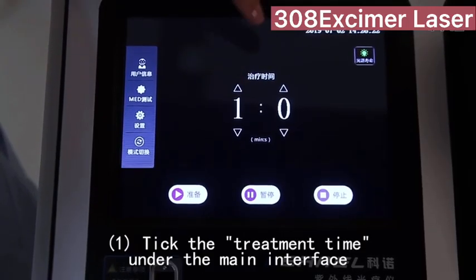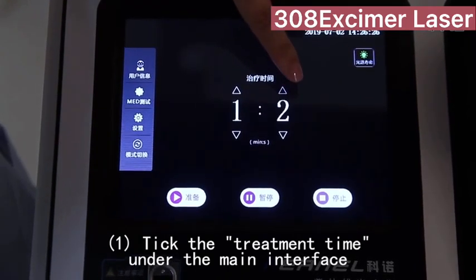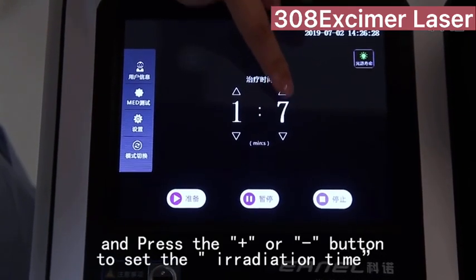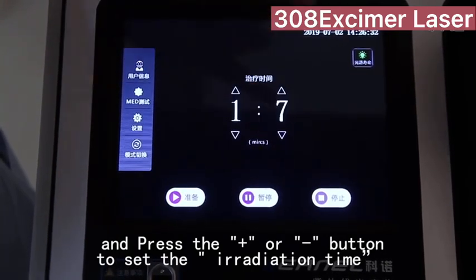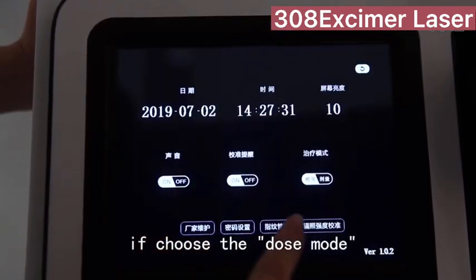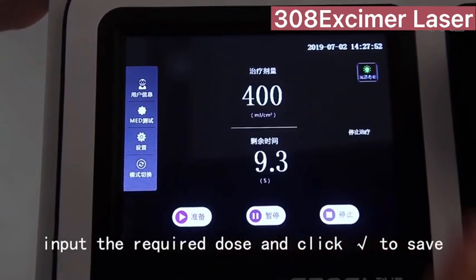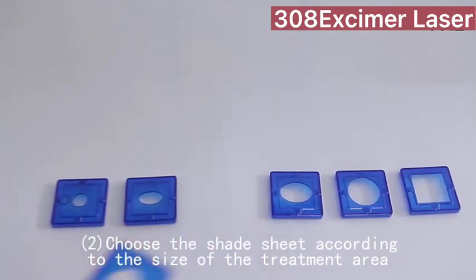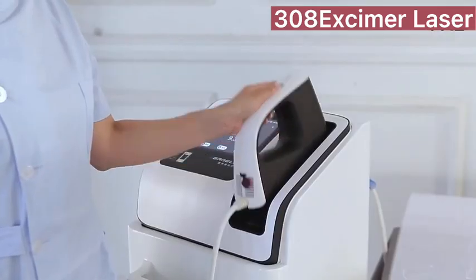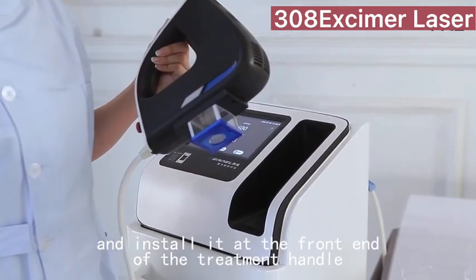Step 4: Treatment. Tick the treatment time under the main interface and press the button to set the irradiation time. If choosing the dose mode, input the required dose and click right to save. Choose the shade sheet according to the size of the treatment area and install it at the front end of the treatment handle.